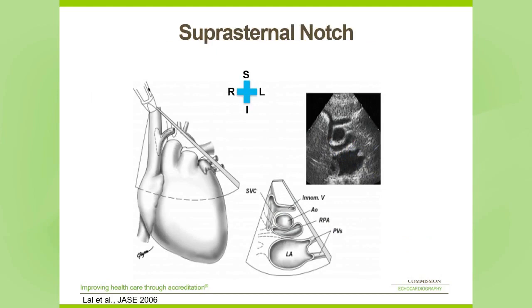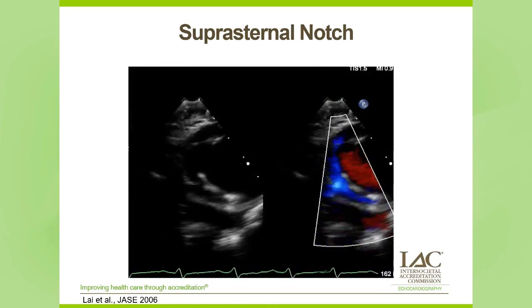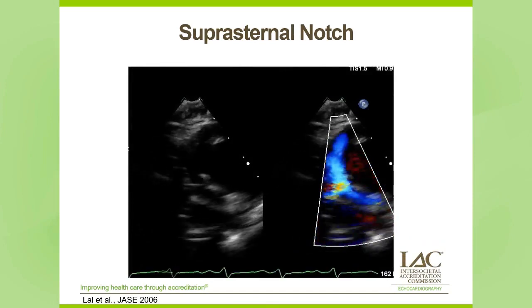The suprasternal notch views are also important in congenital imaging. In the suprasternal notch three-o'clock view, we can see the left innominate vein, the right SVC, transverse aorta, right pulmonary artery, and the left atrium. This view is important because many adult congenital patients have a single ventricle repair which involves a Glenn shunt — the SVC is disconnected from the right atrium and connected to the RPA. Here is an example of a patient with a Glenn shunt demonstrating an unobstructed Glenn shunt leading into the pulmonary artery.